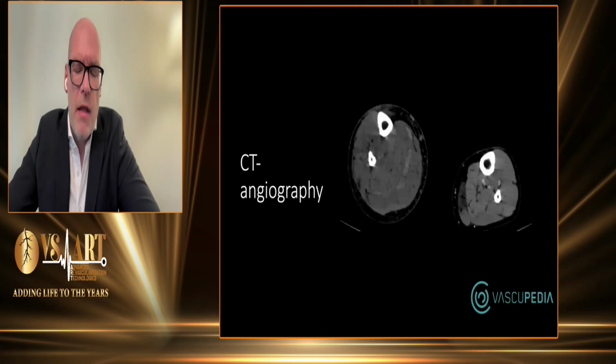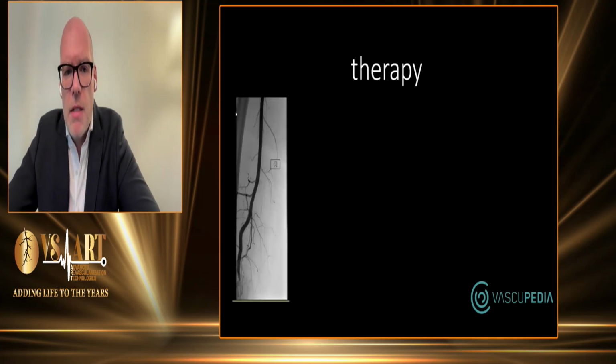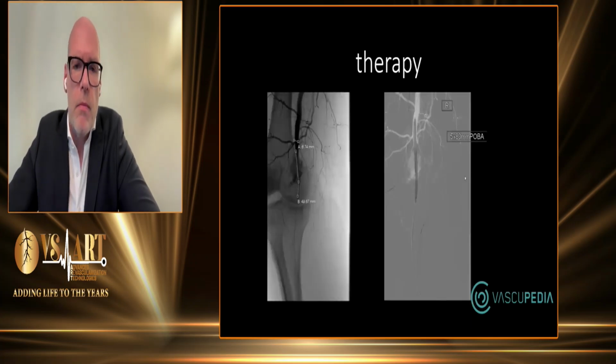And what we identify in the angiography is a normal artery in the SFA area, but then there was a rupture, and the outflow was very, very low. It was very terrifying to see this young man, and we wondered how we could treat it. In our opinion, we supposed to do it endovascular and not operative in that area.